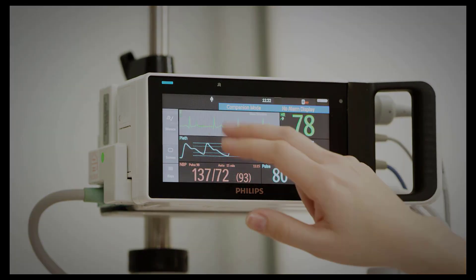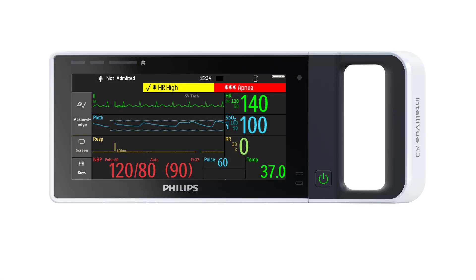Let's take a closer look at the screen. The screen is made up of different areas. This is the monitor information line, displaying amongst other things the patient name. The status area shows active alarm messages or the alarms-off symbol when all alarms are switched off. The measurement area displays the clinical measurement values, waveforms, trends, and clinical applications.